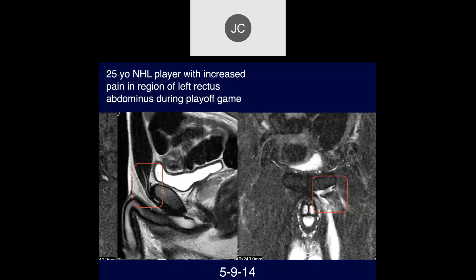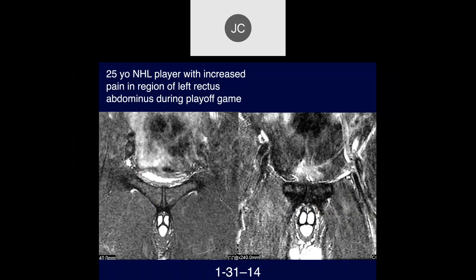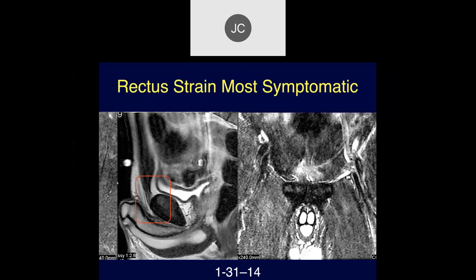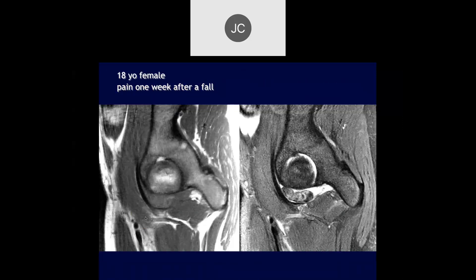On the follow-up from 1-31-2014, the adductor injury looks almost completely healed. There may be a little bit of increased signal intensity within the distal rectus abdominis muscle — a little bit of edema in the region of the rectus abdominis insertion. This was thought to be a strain of that distal rectus abdominis insertion.